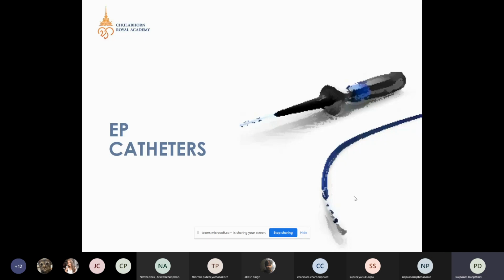normally the doctor will use the femoral vein to insert the diagnostic catheter and try to place all of the standard catheters at the different sites inside the RA and the RV, right? If the doctor wants to insert that catheter into the heart, they need some opening tract before inserting into the vessel, which is a sheath.